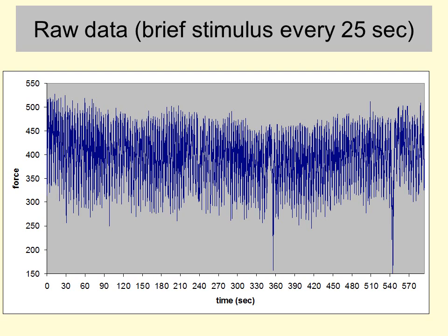Could be an auditory stimulus or a visual stimulus or something that was both auditory and visual at the same time, and we wanted to then see what the response was to that, but also we wanted to allow plenty of time for whatever response happened to return to its baseline. Because we didn't know what the shape of the response would be, we couldn't do the kind of thing they do in fMRI where they model signal summation. We just had to see what the shape of the response was.